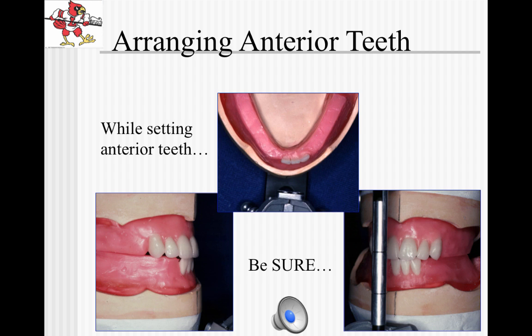Next, check the protrusive and lateral movements. The teeth must have kissing contact. Also watch to make sure that you don't get any wax on the wax occlusal rims, or you'll change the vertical dimension. The pin must stay at the 0 mark, and it must stay in contact with the incisal guide table. This picture shows a lateral incisor with a slight mesial-distal inclination, and it's relatively parallel to the vertical drawn to the occlusal plane. It has a middle prominence when viewed from the side.